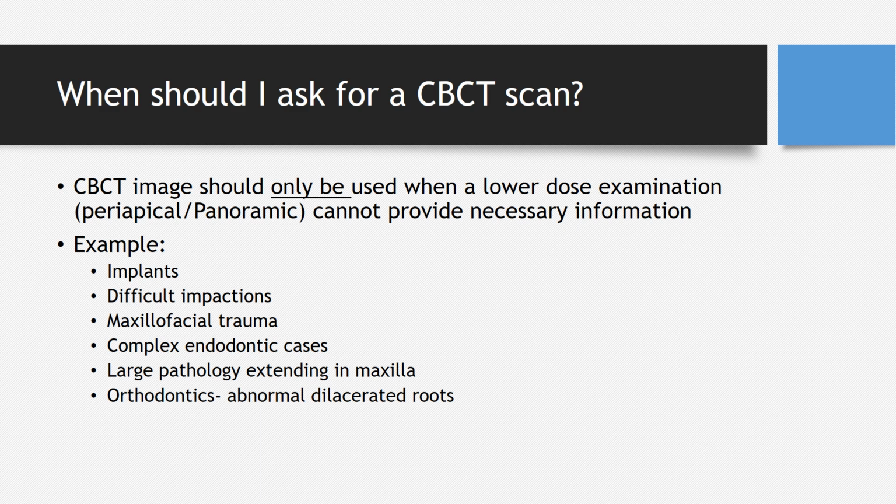So the uses of a CBCT scan would be, for example, for implants, difficult impactions, maxillofacial trauma, complex endodontic cases, large pathology extending in the maxilla, and orthodontic cases where there is, for example, abnormal dilacerated roots, or even orthognathic surgeries where it is important to see all the facial structures and the area that is lying within the surgical field.